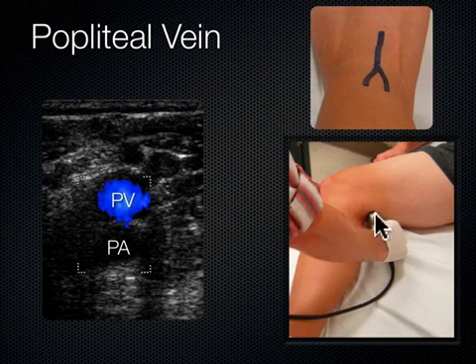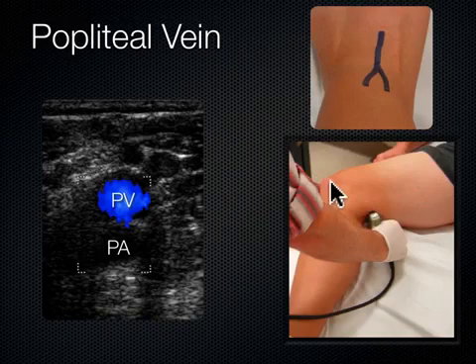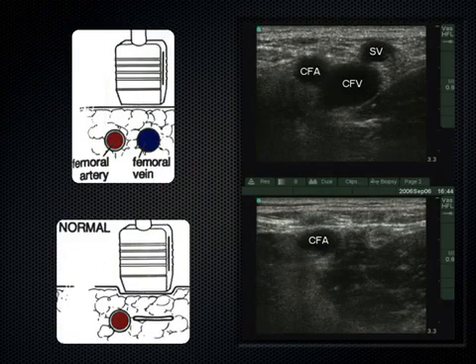I take my other hand, in this case my left hand, I put it on the patient's knee, and then I push these two things together. So I use my left hand to help stabilize the pushing. Now, in somebody who's of normal body habitus like this person, it's not that crucial of a maneuver to use your left hand. But you can imagine when you have patients who have much larger legs, or sometimes very muscular legs with very prominent biceps tendons, you're going to need to really get in there and use both hands and squeeze them together to get those vessels to coapt.